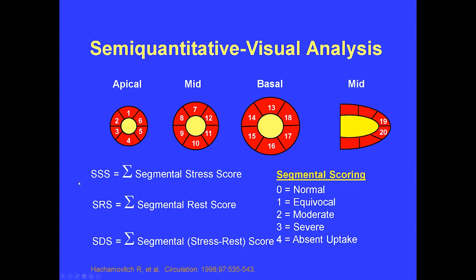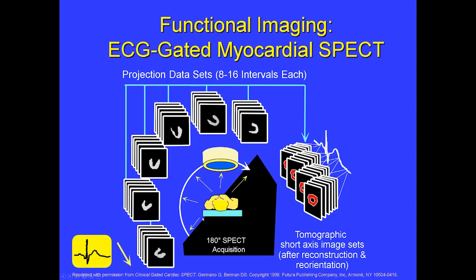In the nuclear cardiology literature, each of these values has great prognostic implications, as well as assisting in deciding whether somebody should move towards medical therapy or interventional therapy. So this is something to be aware of, and it may sometimes be helpful to convey to clinicians if they are looking for guidance on how to manage the patient.